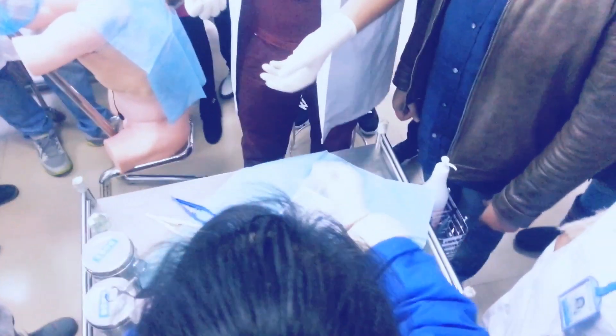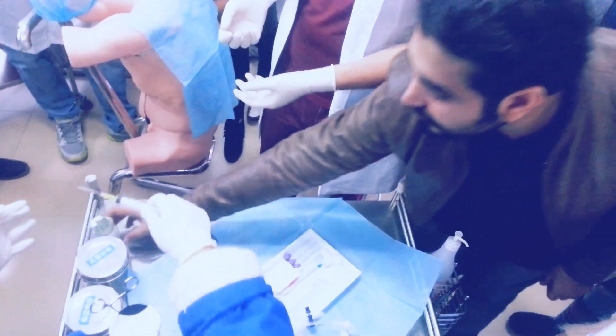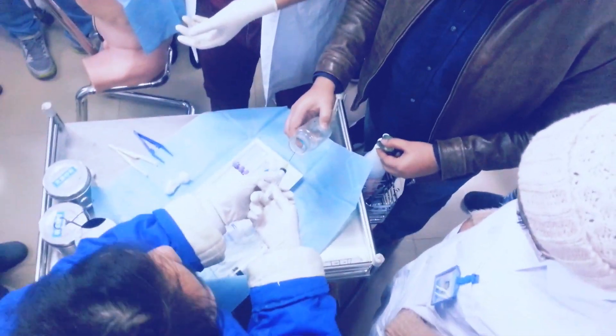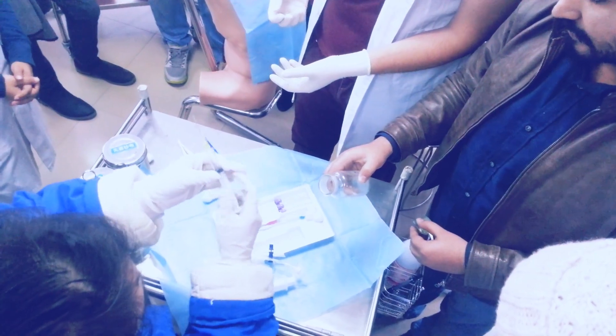Then my assistant will give me anesthesia — 5 to 6 cc of lidocaine. Here is the lidocaine. Only maybe 3 to 5 cc.